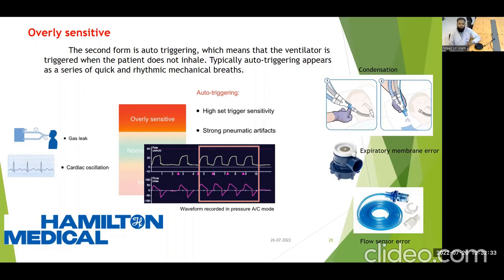So we should discard it after every patient, or after 28 days on a single patient. If 28 days are done, we should discard the flow sensor and put a new flow sensor on the ventilated patient. We have a 7-day life for the breathing circuit.